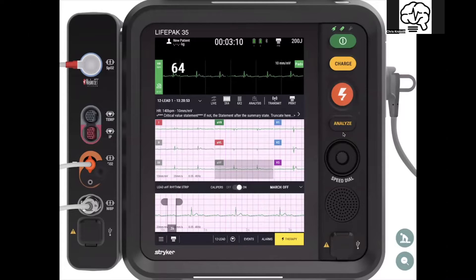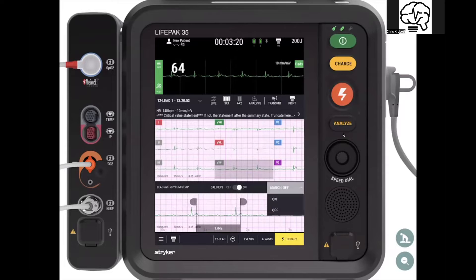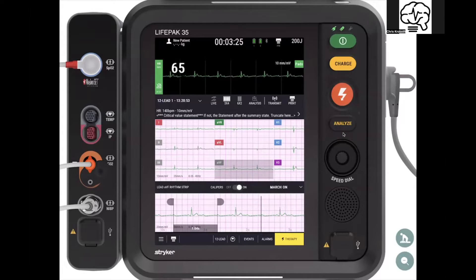You tap on the calipers and you can say, 'That looks like a P wave — I'm going to have this one march out.' You can either manually do it or say 'March on.' Depending on however big or small you build your calipers, it will actually march out multiple sets of those calipers for you. You see one-second, two-second, three-second intervals, and as you change, the march feature also changes — a really sweet rhythmicity measurement feature built into the system.